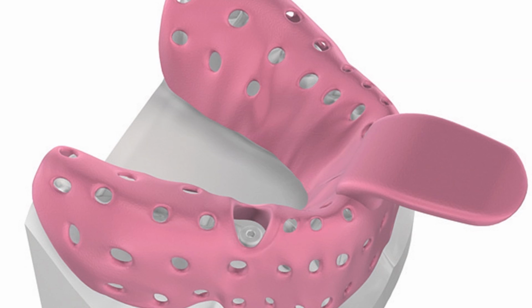And basically they have an orifice on the top of the tray, a hole made into the tray in order to allow the implant impression coping to stick outside. So when you take this impression, you can clean any impression material off that orifice that engages the impression coping onto the fixture or the implant, unscrew it, and remove the whole thing as one piece.